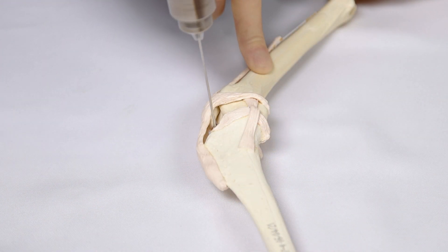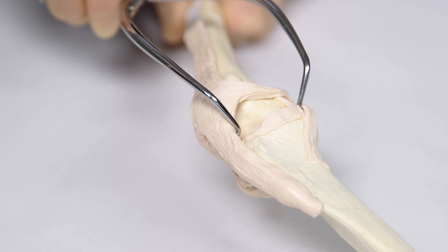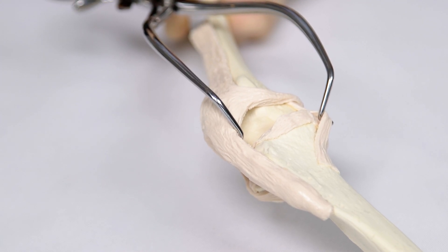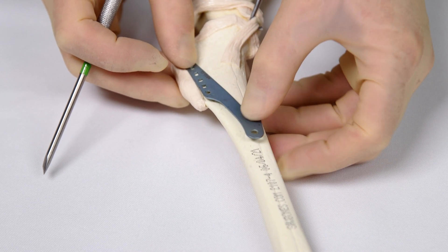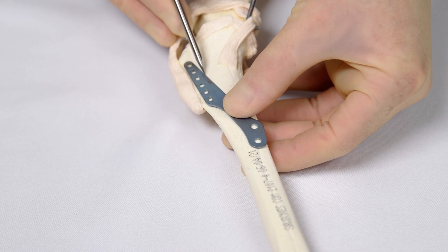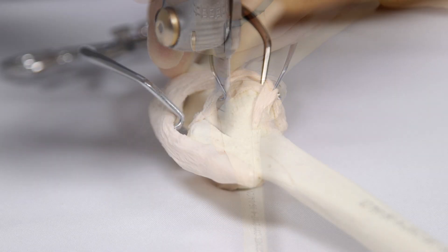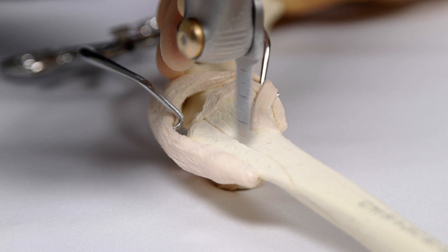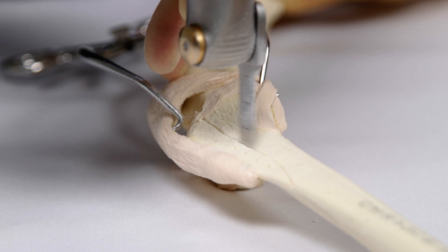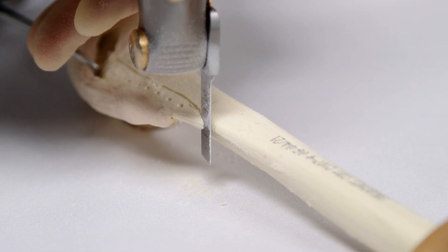Place GELPI retractors in the joint to reflect the patellar ligament cranially. This avoids damage during creation of the osteotomy. Place the plate over the tibia and mark the point at which the plate no longer covers the osteotomy scribe line. Use an oscillating saw to make the osteotomy, using the pre-scribed line as your guide. At this stage, the proximal section of the osteotomy should be monocortical. Distally, it should be bicortical.